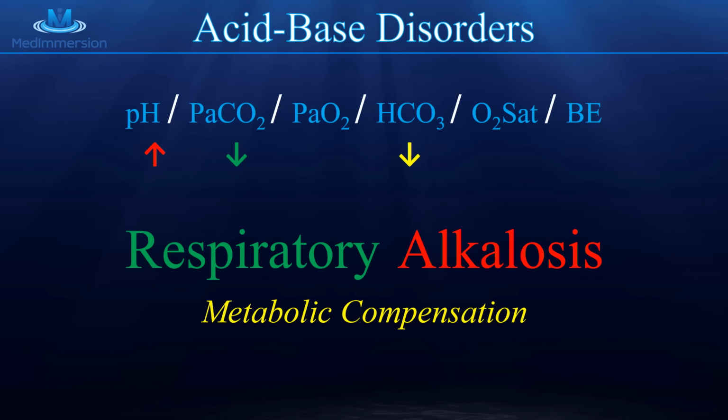What? Is it really that easy? Yeah, it is. It's that easy. The other stuff, I mean, who's going to pimp you about the PaO2? Who's going to pimp you about the hemoglobin? Nobody. They just want to know, can you read the acid-base disorder? The base excess on the end, that can come into it a little bit later. But that's just going to kind of follow the pattern that we've already talked about. It is that easy. Let's do some more examples.